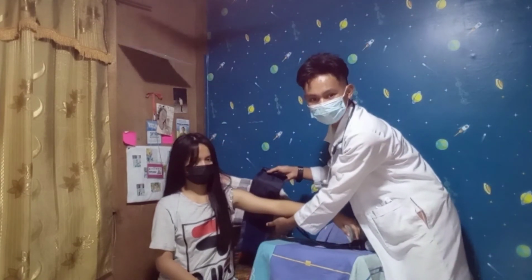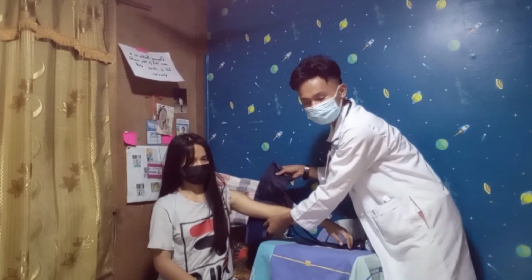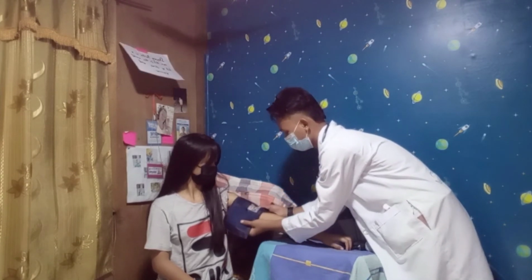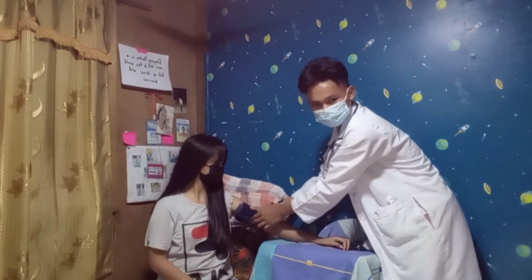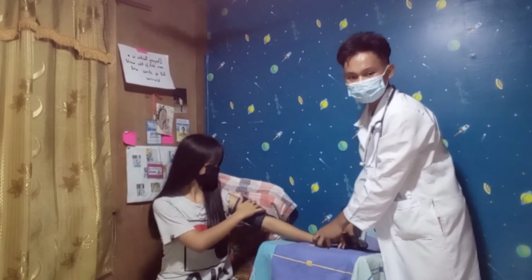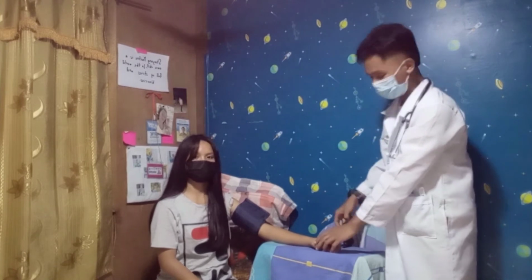Ensure the cuff is snugly fitted by inserting your fingers into the BP cuff. Position yourself so that the manometer is vertically at eye level. Observation should not be farther than 1 meter.